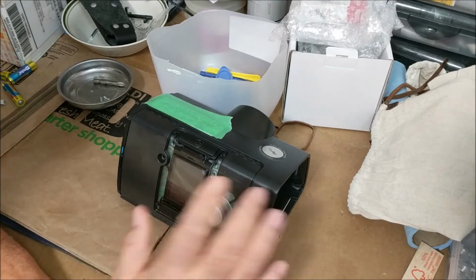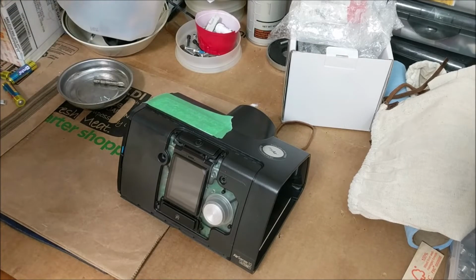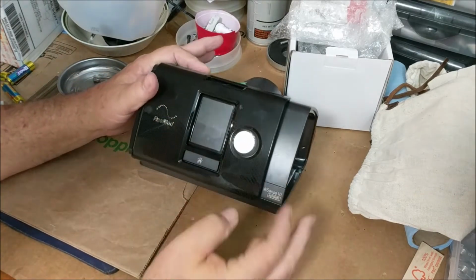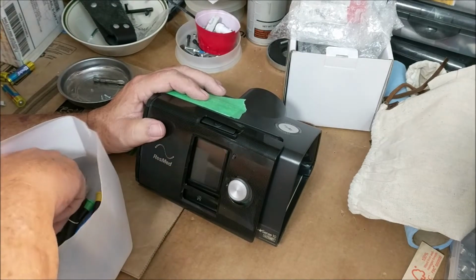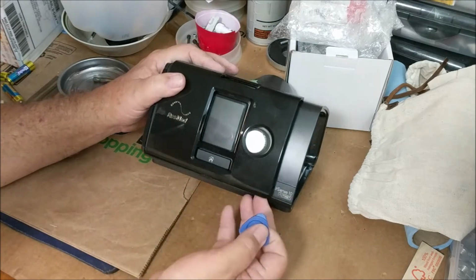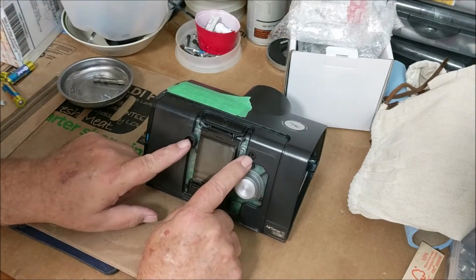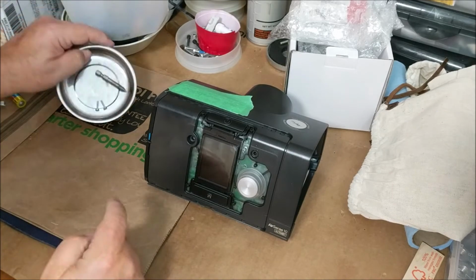I've had this about 2 years and I've never used it because I just hadn't gotten around to disconnecting it. So I'm just going to go over this real quick. There's a little indentation here. I got some cell phone tools because I changed a battery in a tablet, so I'll use those. I flip this cover up, then I flipped the top up, and this came off. It's got 2 screws here. Those come out, and I've got them on a tray here.